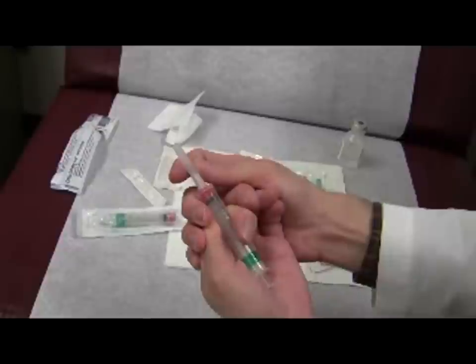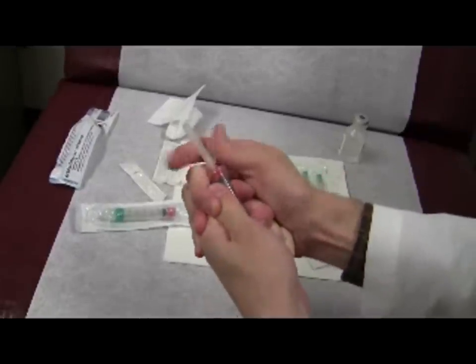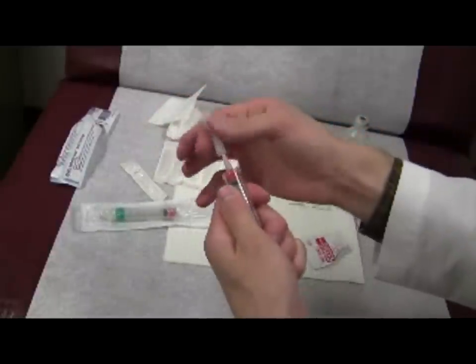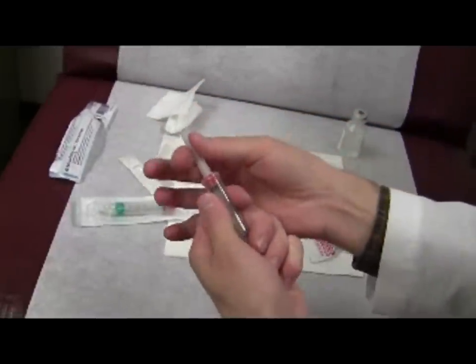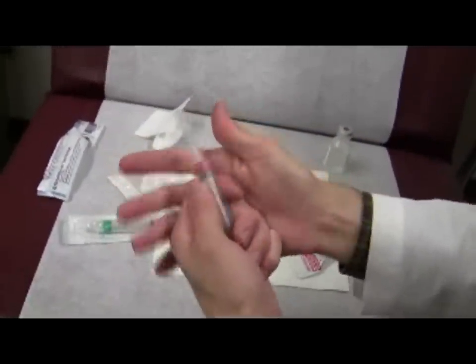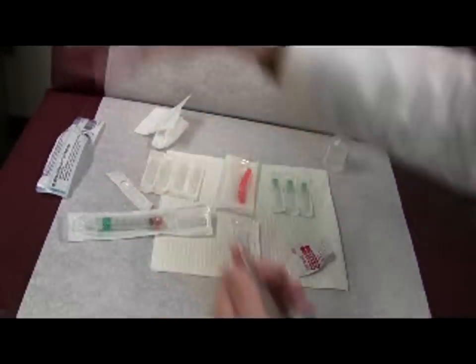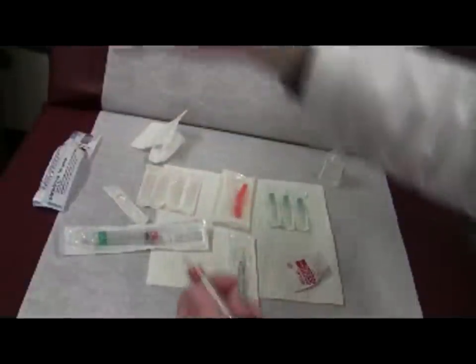Doing it the right way — I just let it open, and now it just comes off without force. Some people will not have this attachment here and they'll just go like that. When they go like that, it's an uncontrolled motion and your hand can get cut.